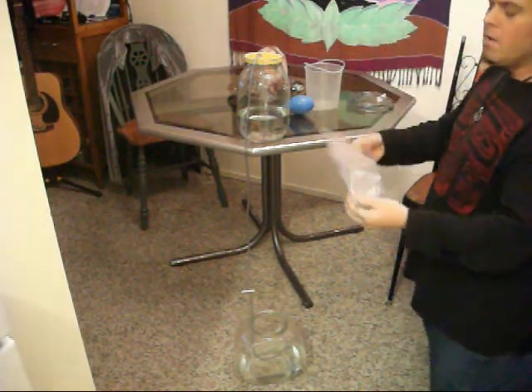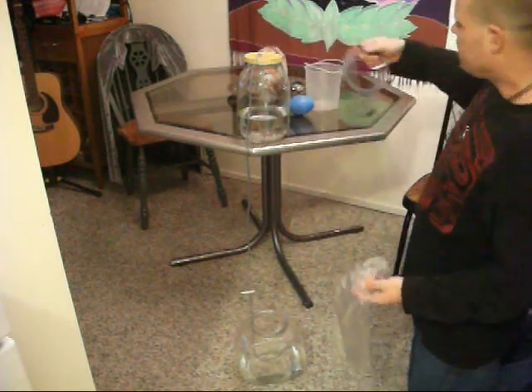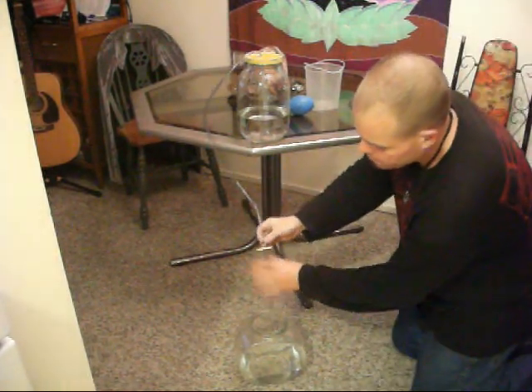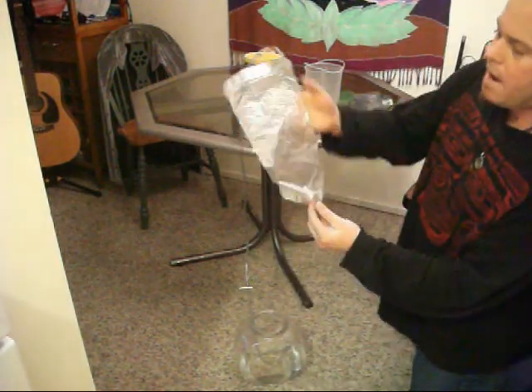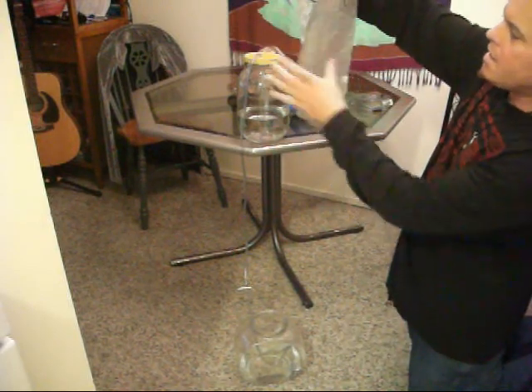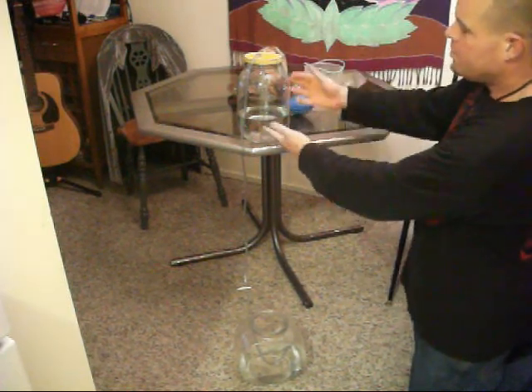What you do is you go buy a cheap disposable enema bag, and attached to it is one of these. It's got the little clip here to turn it on and off, and then it's basically a piece of plastic tubing that is connected to the bag. So you hang the bag on your shower and you do your enema, but these can get dirty and they don't last forever, so they're also plastic. So the part that the liquid is in will be glass.